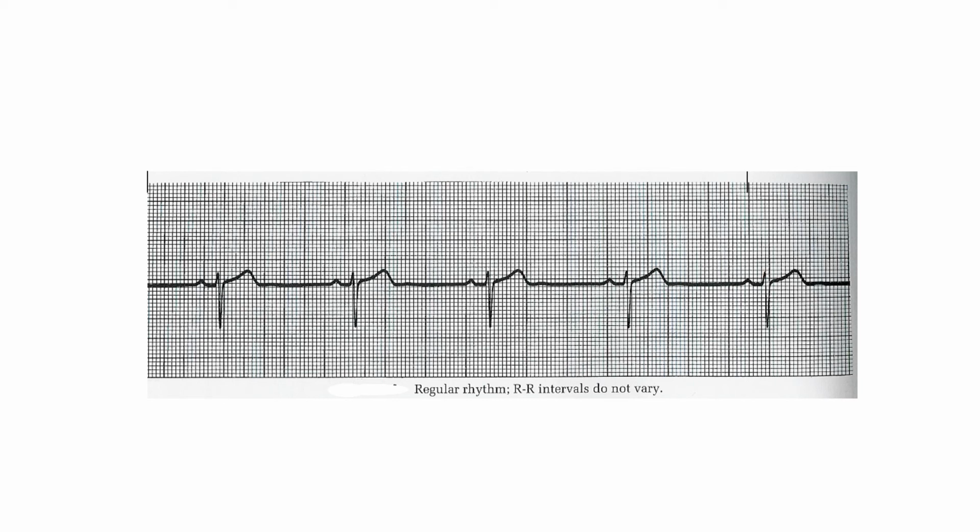Now, if I were to use the 6-second quick heart rate calculation, from here to here is 150 baby boxes. I already did the math. So I'm going to count how many R waves are in there. I'm going to draw a line. I will only count the R waves between this 6 seconds, so I will not count that complex.